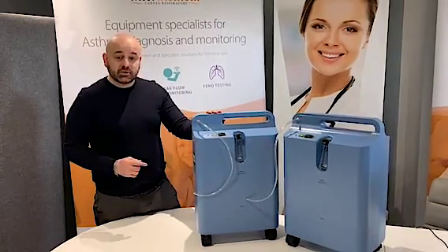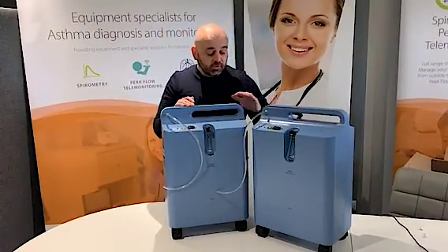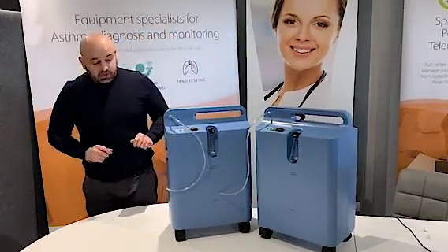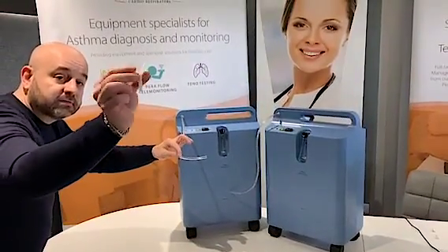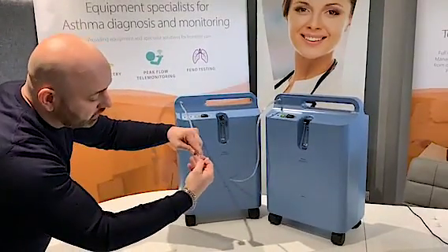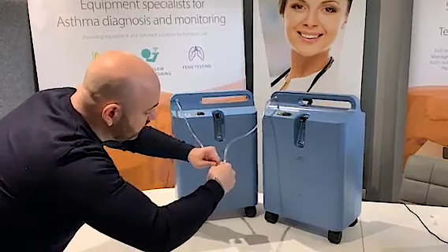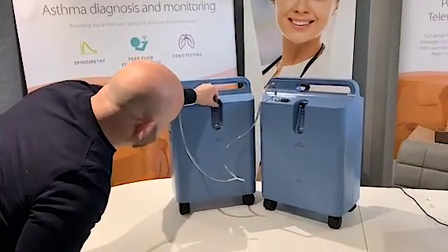These are two Philips EverFlo oxygen units, 5L each. We just switched them on and they've been running for 2-3 minutes so the oxygen purity is at the optimum now. With two simple pieces of tubing and a Y connector that you can see here, we will connect them both — one and two — make sure they are connected firmly.